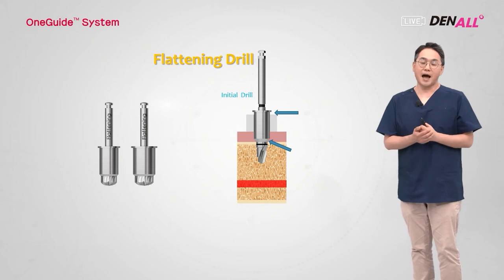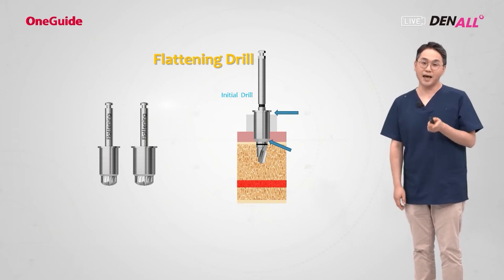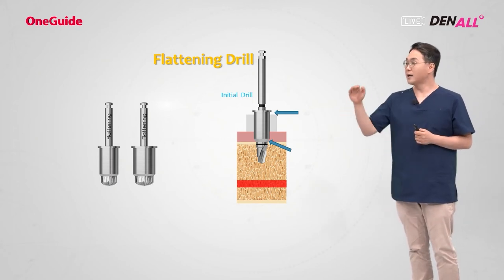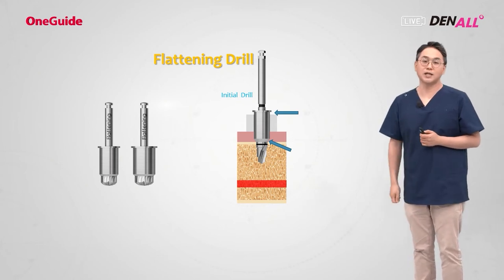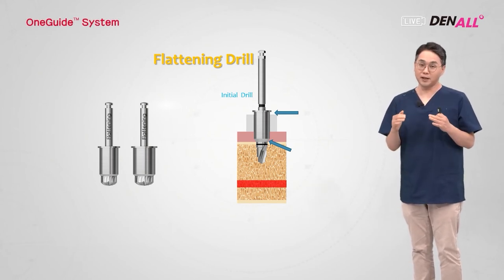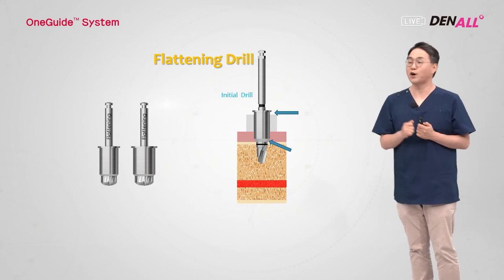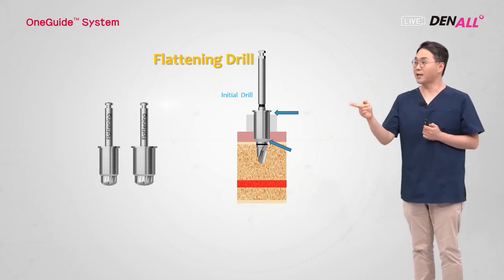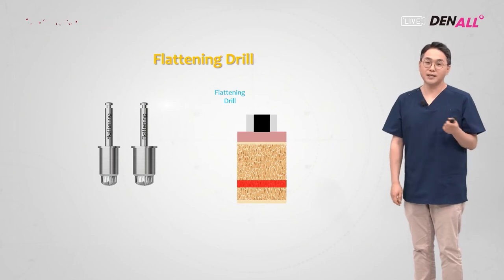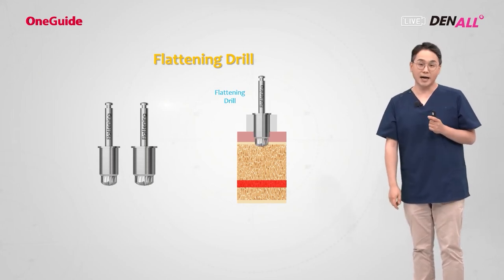If you look at the anatomy of the drill and barrel, it has a transitional part, the bevel part, and there's no cutting edge there. When the bevel part meets the cortical bone at the top, it cannot be advanced anymore. TS3 bone level internal connection type implants are placed 1 millimeter deeper subcrestally. Then the drill should go deeper, but the crestal bone meets the bevel part. It cannot be advanced anymore. You need to remove the drill and flatten the crestal part so that you can go to the sufficient depth. 2 millimeters of crestal bone can be removed using this flattening drill.